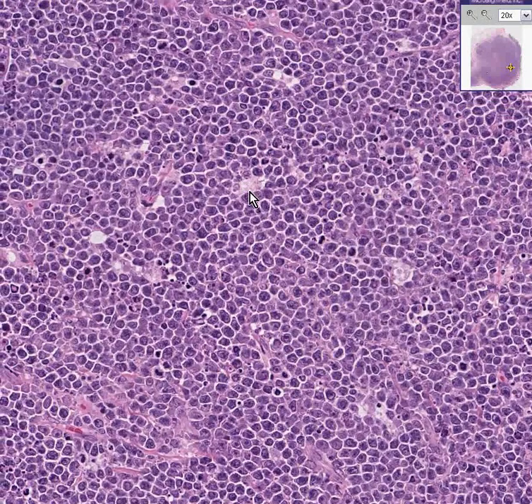And if you can see, the star represents a cytoplasmic area relatively void in nuclei, but surrounded almost like a rosette in neuroblastoma with tumor cells. The tumor cells of Burkitt's lymphoma are very, very undifferentiated, but they still look like lymphocytes, don't they? Because they have minimal cytoplasm, generally round or oval nuclei, and they stain very, very bluish. Notice how there's very, very little cytoplasm in these cells.